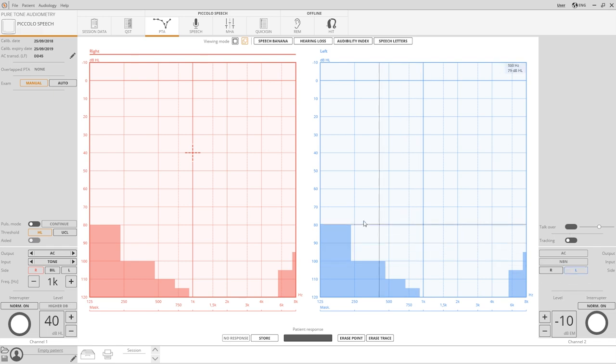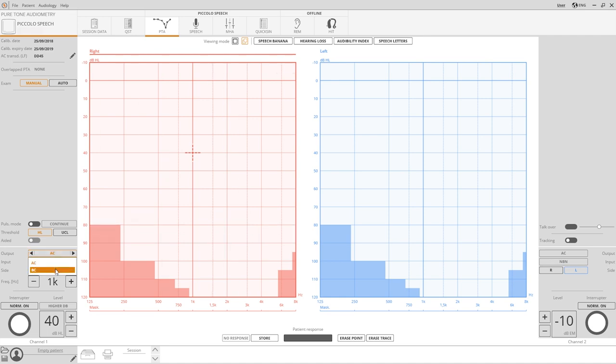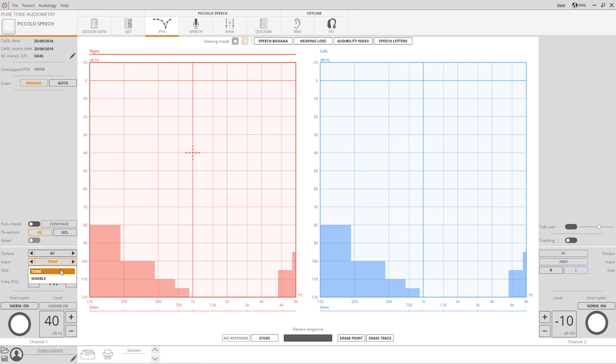Transducer selection can be done by clicking on the output selection. Click to switch from air conduction to bone conduction or select the desired option from the list. Click on input to decide whether to send a pure tone or a warble tone as a stimulus.